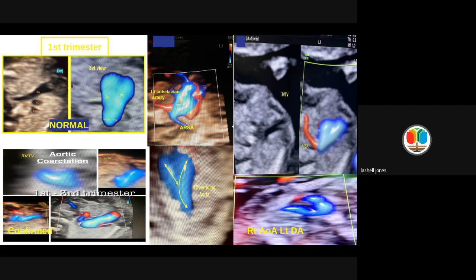So you see, we can pick up these diagnoses pretty early on. I showed this example earlier where you can see the subclavian artery, and then here you can also pick up the aberrant right subclavian artery. I just wanted you to see that it is bilateral. Pretty cool to see that.